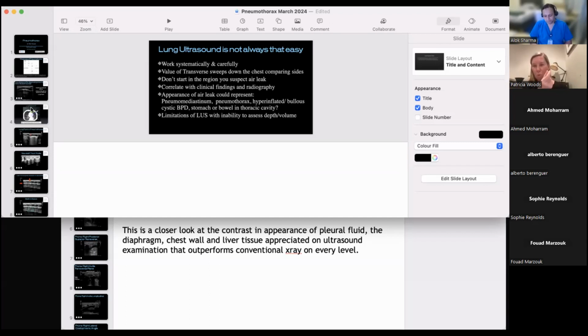drastic change within one lung region, and it should be really between one intercostal space that you're able to nail it to. It's hard to fully explain what you're observing. It's probably not that significant in that context if it's so tiny and it's flicking in and out. And remember, nothing's 100%.